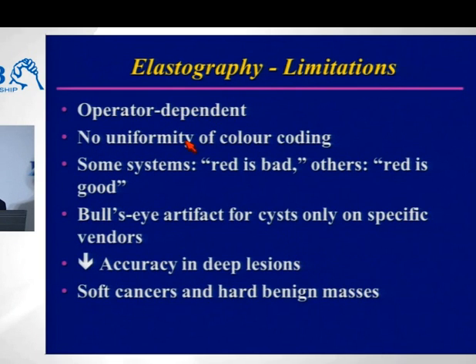Limitations, again, operator dependent, no uniformity of color coding, and in some systems red is bad, and others blue is bad. I think I'll stop there because I've reached my time.